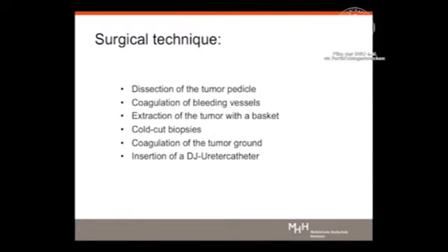Surgical technique: dissection of the tumor pedicle, coagulation of bleeding vessels, extraction of the tumor, cold cut biopsies, coagulation of the tumor ground, insertion of a double-J ureter catheter.